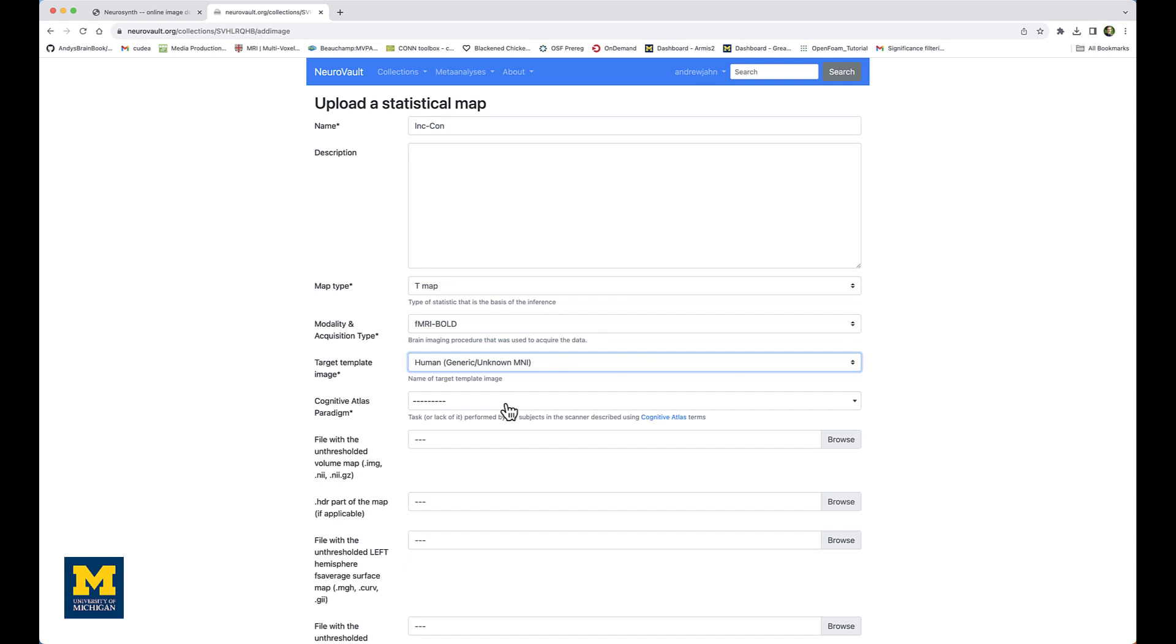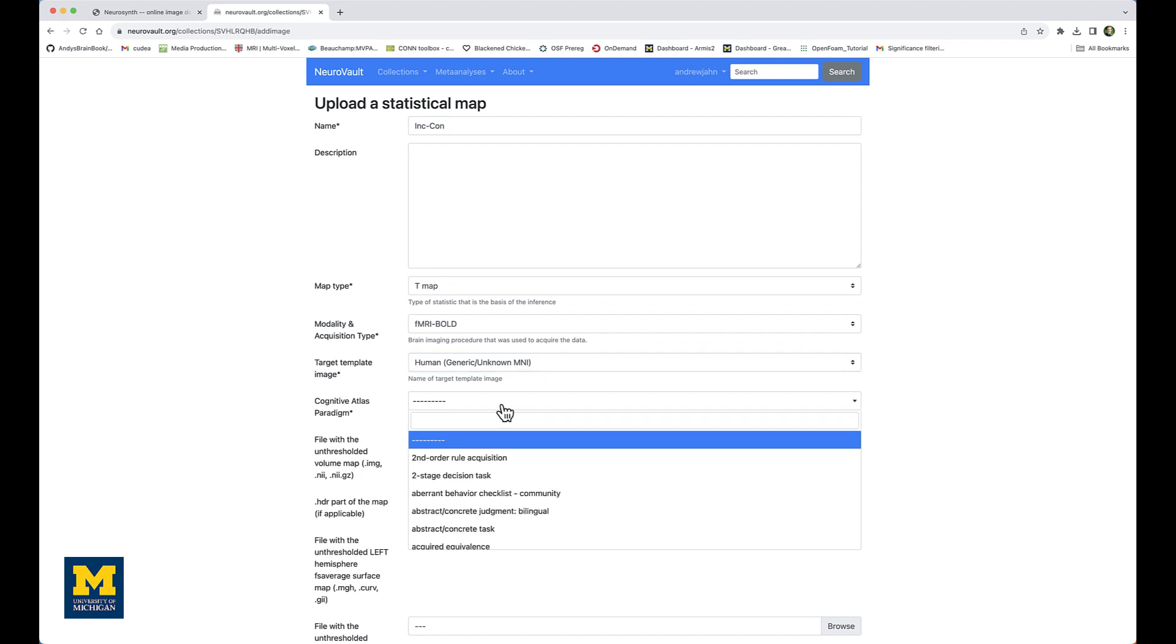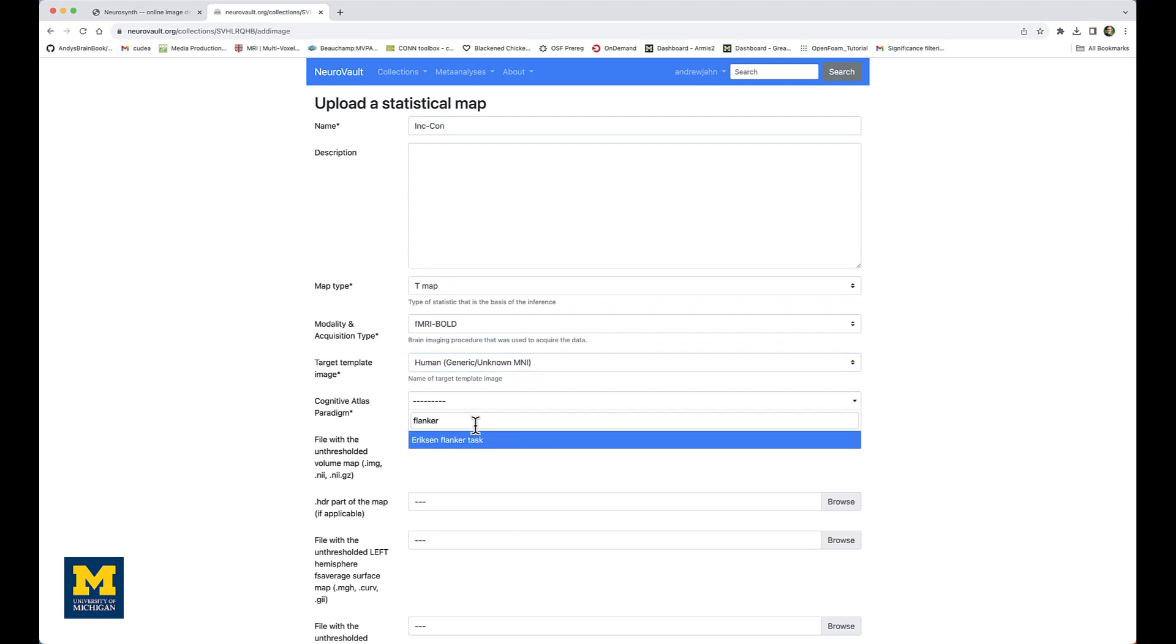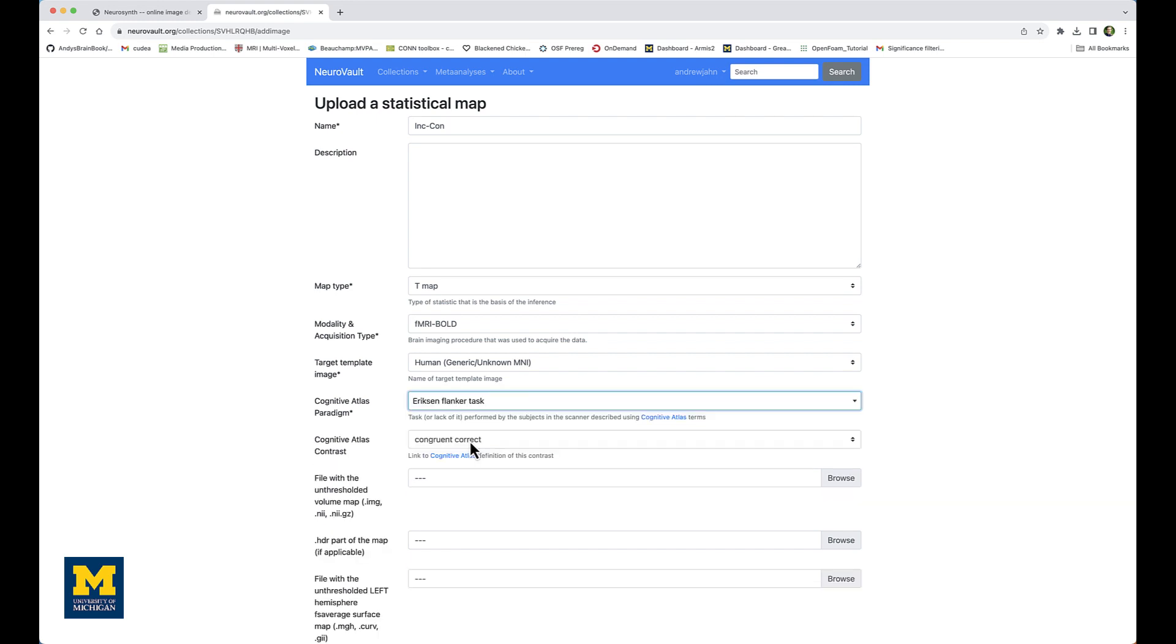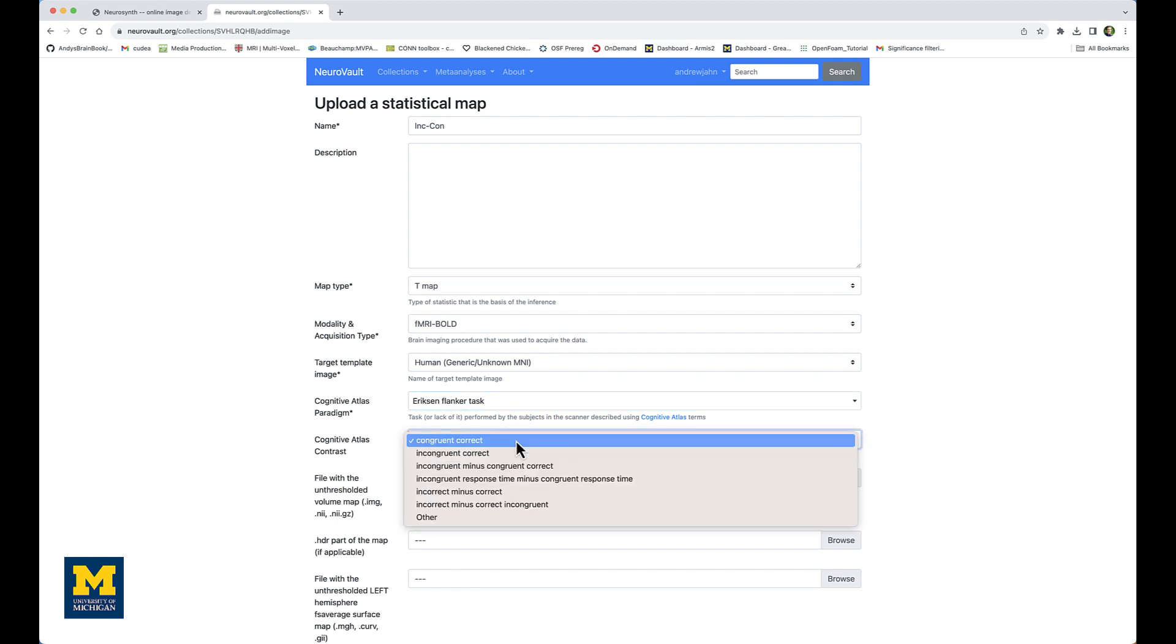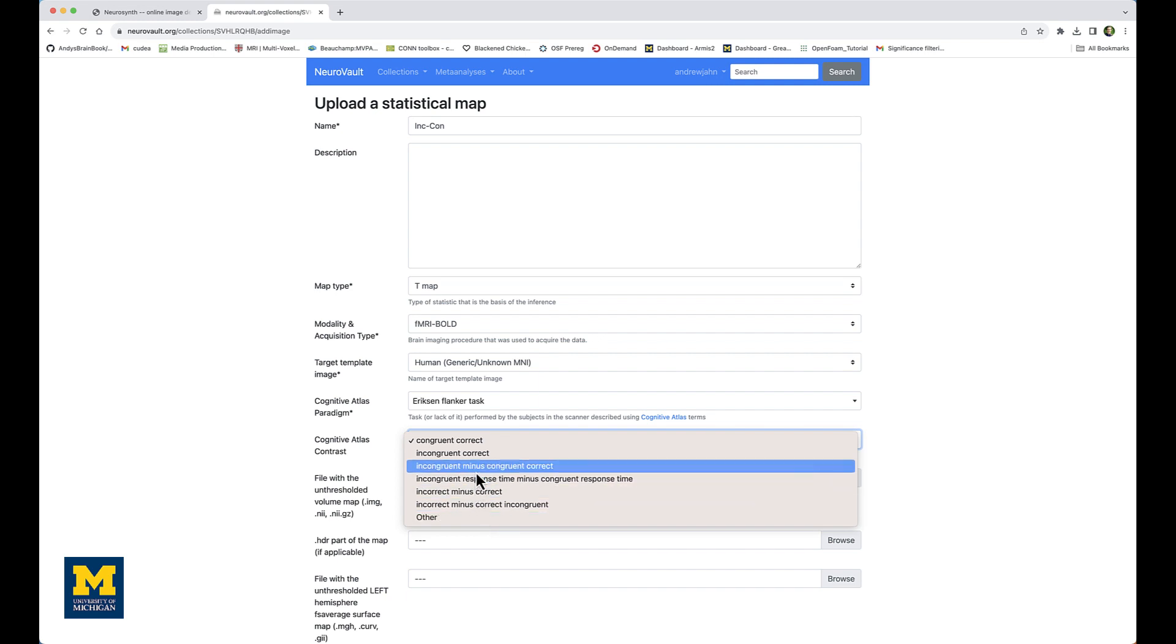For the Cognitive Atlas paradigm, there are many different ones you can select from. In the search field, I type flanker and select Eriksen Flanker Task. Under Cognitive Atlas Contrast, these are default ones loaded from that specific atlas paradigm. I could select 'other' if I wanted a custom label, but in this case, incongruent minus congruent correct most closely approximates what went into this group level analysis.